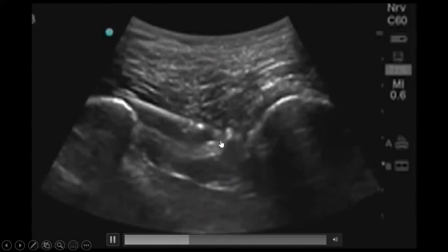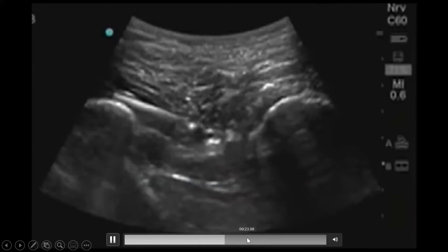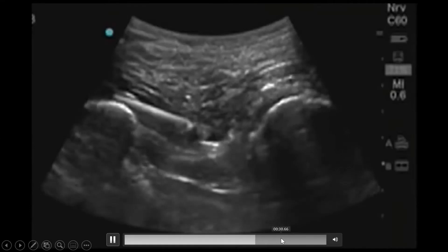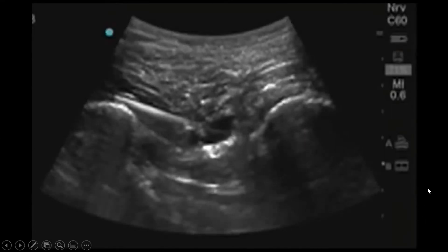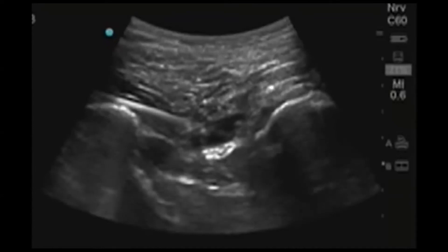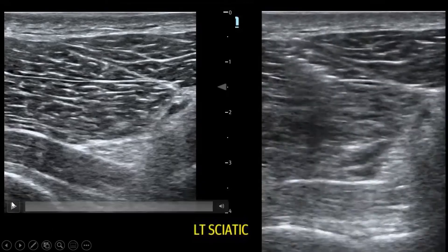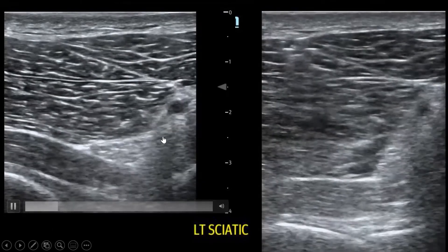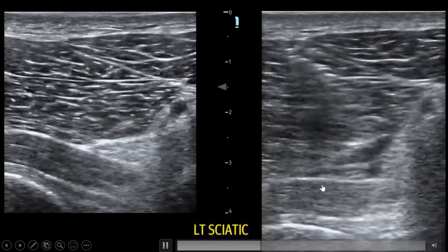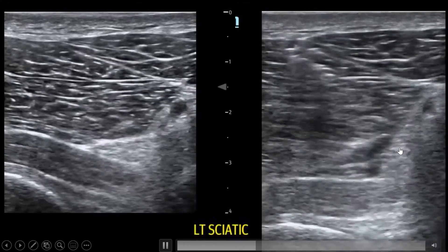You can see the needle coming in here. Here's an example of one that we did — this is our surface scan. You can see a vessel there that we're going to avoid. This tends to be pretty deep, so it tends to not be the prettiest block if you don't have the right equipment. It's better freestanding with a less ideal machine. You can see some flow coming around that sciatic nerve.